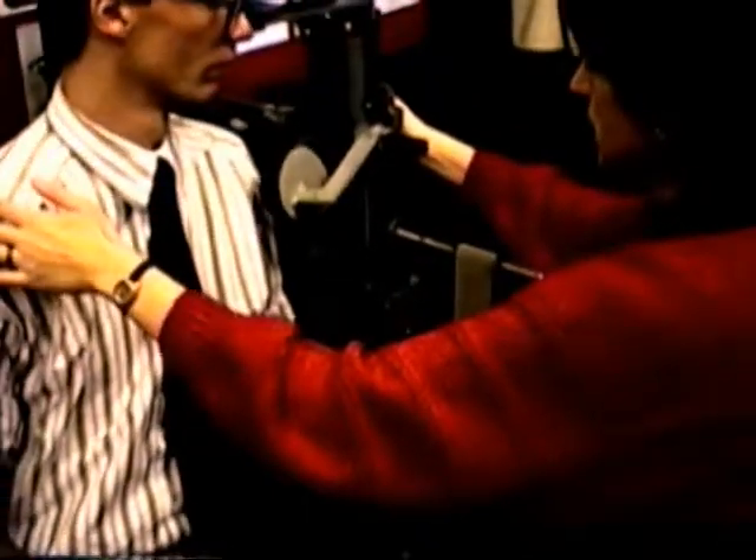It's a lot of adapting devices to fit the device to the person. The essential is to fix every joint without the rotational degree of freedom of the lower arm. And we don't put the force in the feel of the hand, but we turn the arm in the area of the wrist. Because you get quite different values if you make supination or pronation by measuring the plane of the hand.